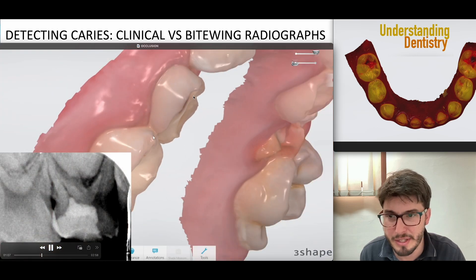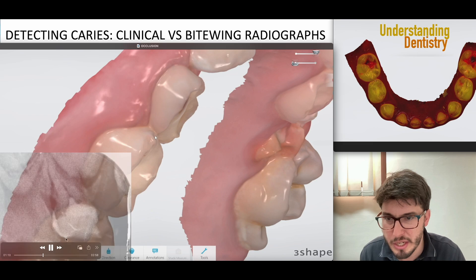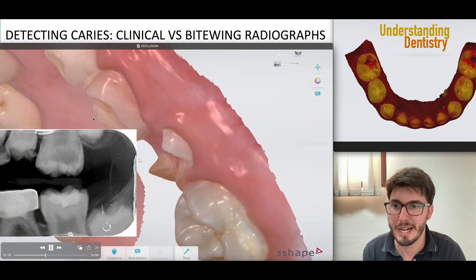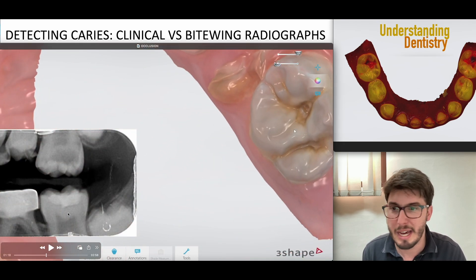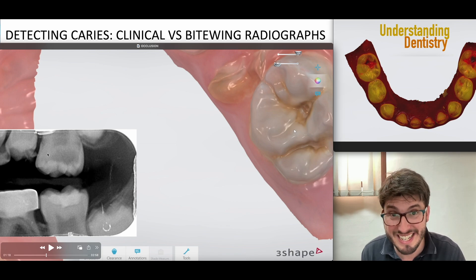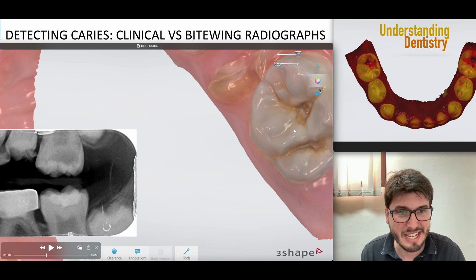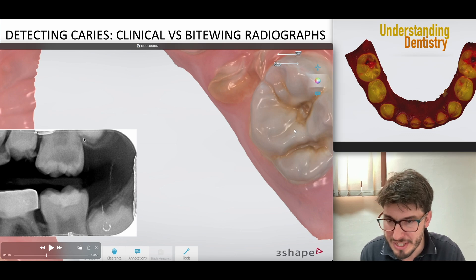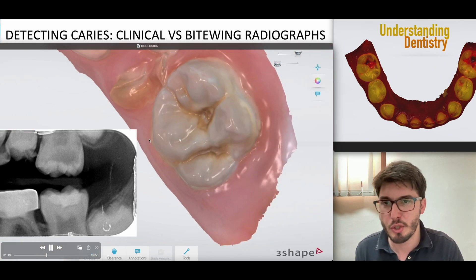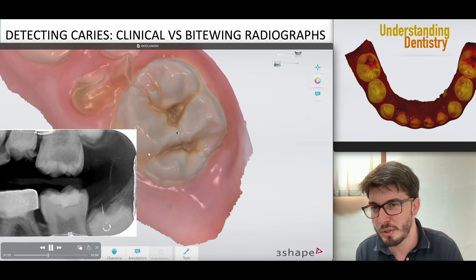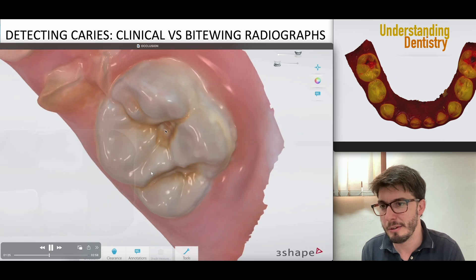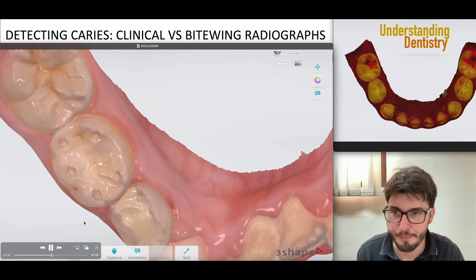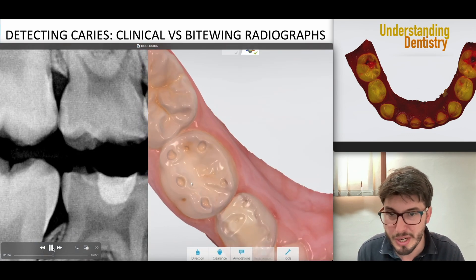Now we have this tooth with tooth wear and a very large restoration — that's the clinical presentation. We do have occlusal caries: take a look at this dentine with cavitations. This is another nice tooth to correlate with the radiograph, though the bitewing was not the best. The adjacent tooth is also broken.